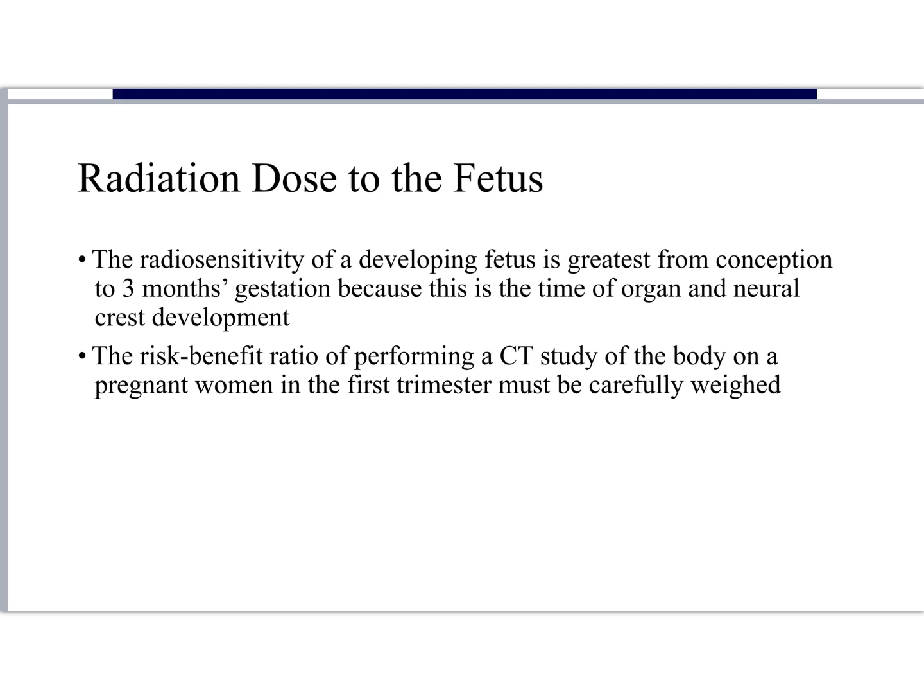So in general, we ask questions about last known menstrual period because we're trying to determine if we're in a sweet spot. And that sweet spot is basically about 10 days after the last period, right? That's going to be a time where even if there was conception at that time, in all likelihood, it's prior to attachment to the uterus, and so it's just kind of a make or break it time for the zygote. So we shoot for that window of within 10 days of the last known menstrual period.